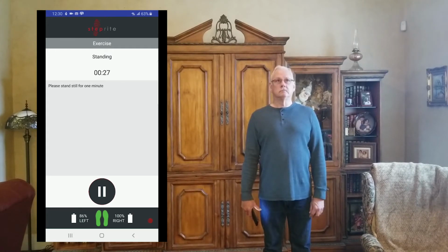on both legs. As you will see in this exercise, the patient is standing still. We don't want them moving arms, nor the head. No movement, as little as possible, is best for this exercise.